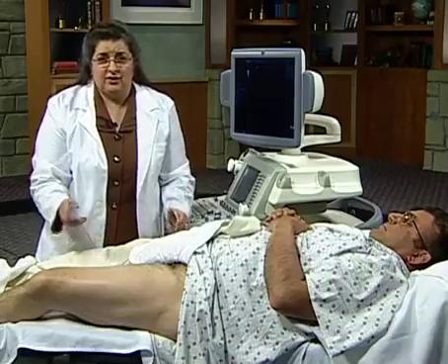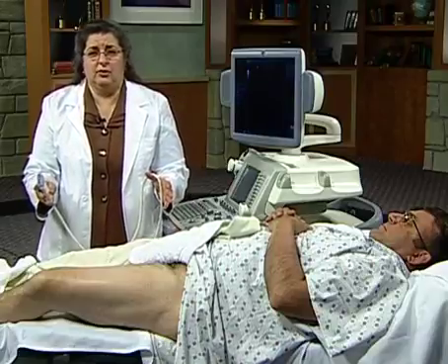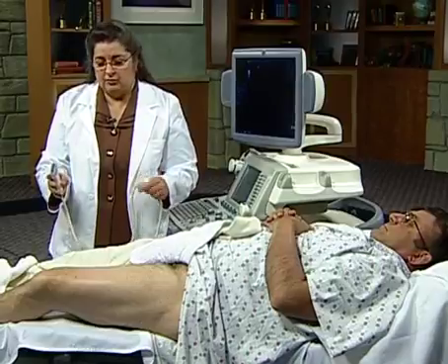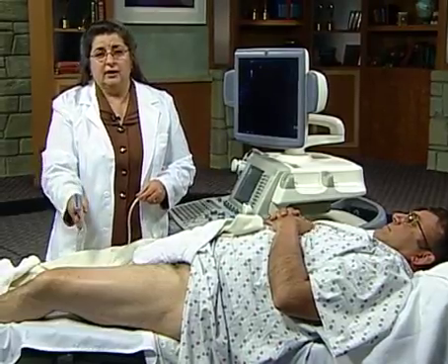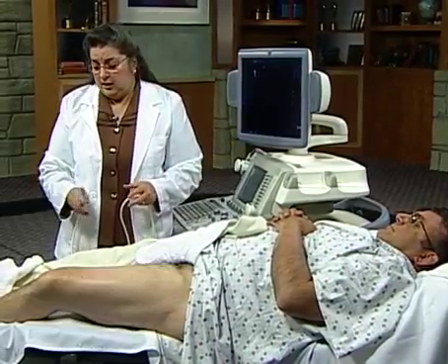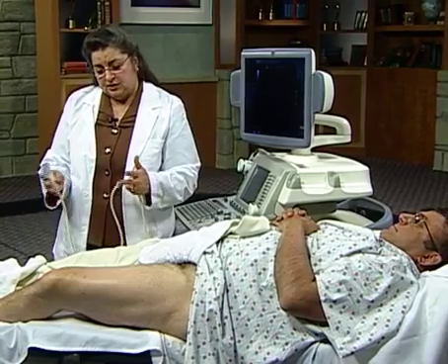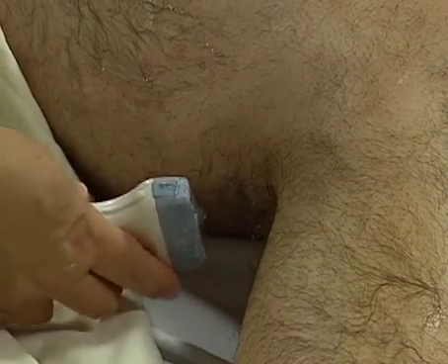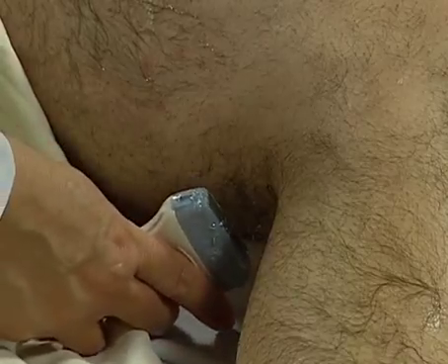Okay, so now we've finished exactly what we have to scan through the thigh. Again, we've covered the common femoral, profunda, and the superficial femoral artery all the way down to the level of the adductor canal. Now, with the patient's limb in this position with the knee slightly flexed, we can get in behind the popliteal space and approach the popliteal artery.